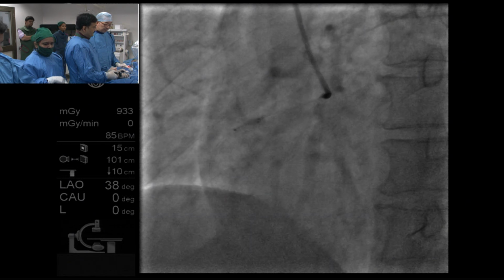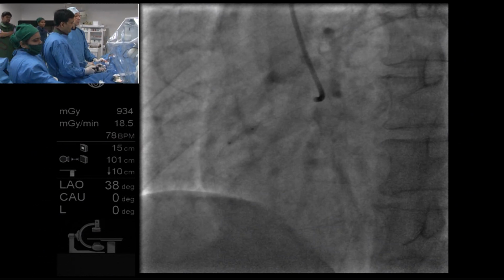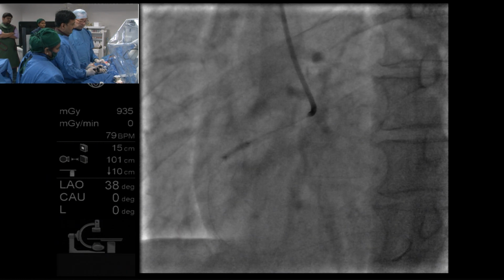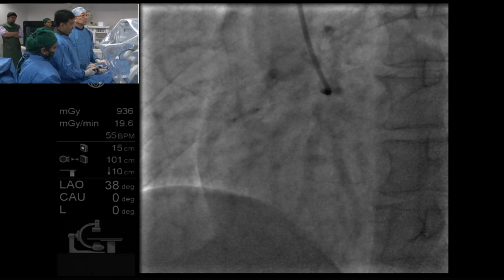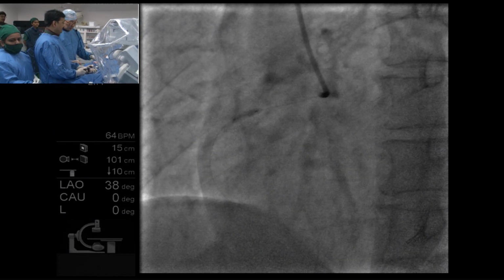Because if you deploy the stent, then you're going to have a problem expanding it. And if you start trying to lithotripsy a deployed stent, there's always a worry about compromise of the coating, the drug and the polymer and so forth. So I always advocate treating the vessel appropriately beforehand and then deploying the stent.